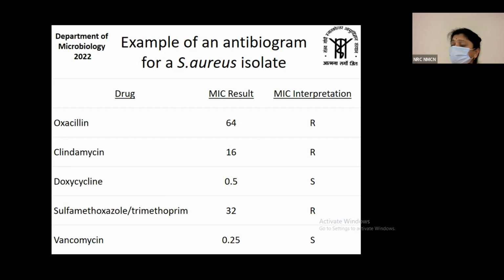An antibiogram is always representative of the antimicrobial susceptibility testing results which we obtain from positive cultures of samples that are sent from patients. So there are 2 domains. There is an infection control program under which come the surveillance cultures which may be taken from the ICU and wards and OTs, and there is a diagnostic category, that is the AST data that is recovered from positive culture isolates, right?